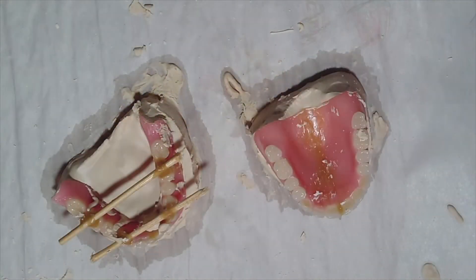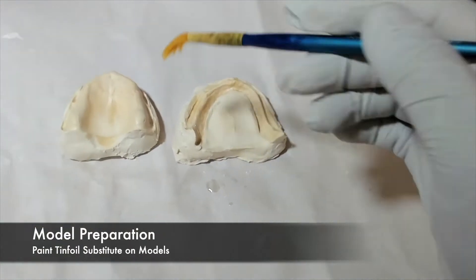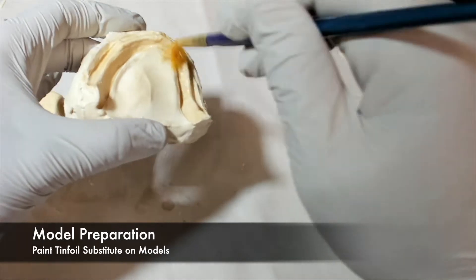Once the models have been fabricated, the dentures come off of the models. Note that it is okay if the dentures break into pieces — they need to be repaired anyway. When the models are freed, paint them with tin foil substitute in order to prepare them for the acrylic to come.